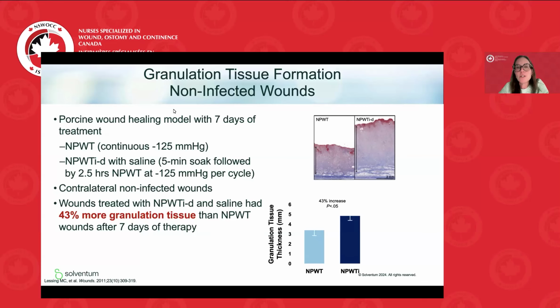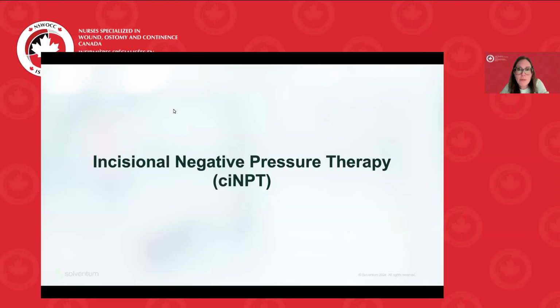The soak time and dwell time, there is some variance, but essentially the key is about 10 minutes every 2 hours. There was a study that was done looking at, what happens if we let that dwell time be longer to 20 minutes, and the 10-minute dwell time actually did better. But again, creative license, I will play with that a little bit depending on the patient and how much I suspect that there's renecrosis. But on the whole, we're going to do about a 10-minute dwell time every 2 hours. Okay, so that's the negative pressure instill and dwell.